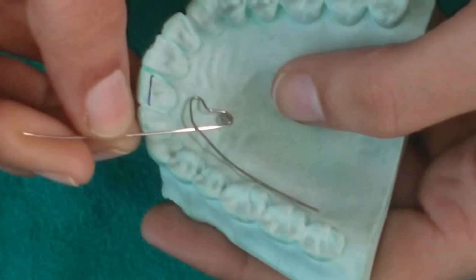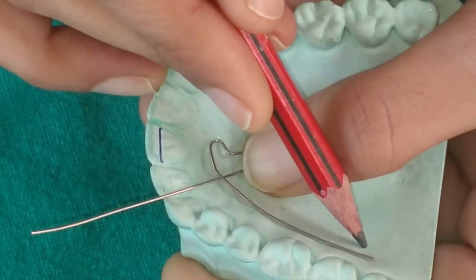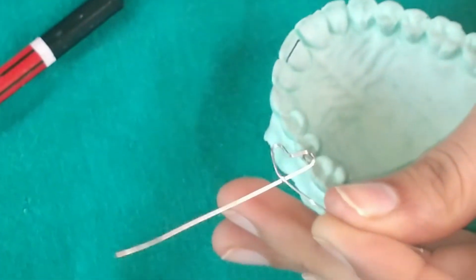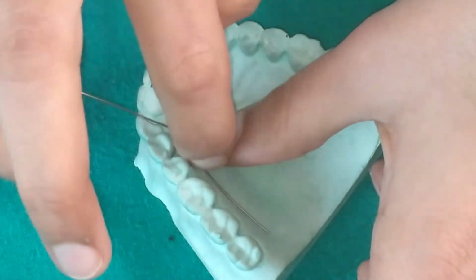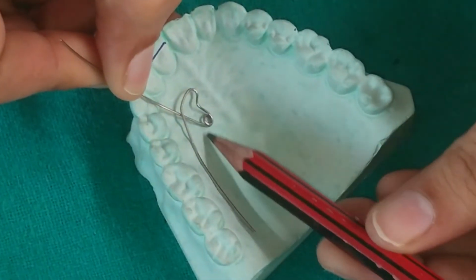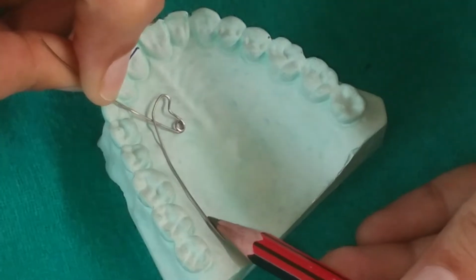This should be the position of the helix and the activation loop, after which the retentive wire should be parallel to the posterior teeth. So we'll be adapting this retentive wire so that the retentive wire is long and parallel to the posterior teeth, like this. This is the helix. The outer wire which was away from the tissue should be distal, bent, given a loop, bent as retentive arm, and should be parallel to the occlusal surface.